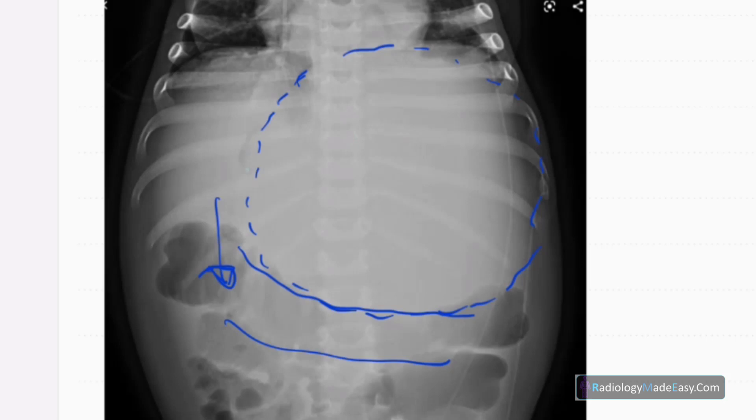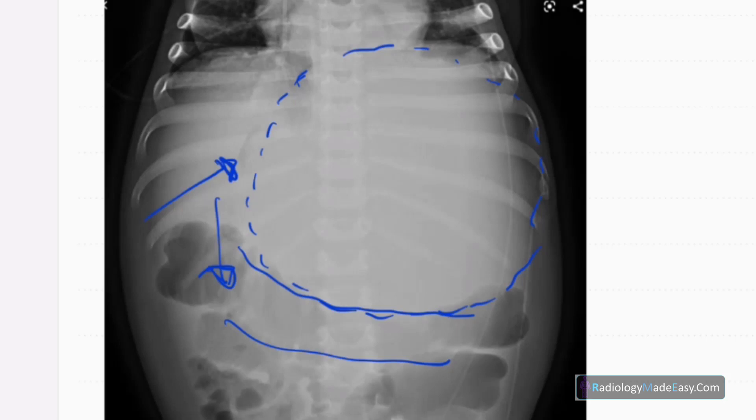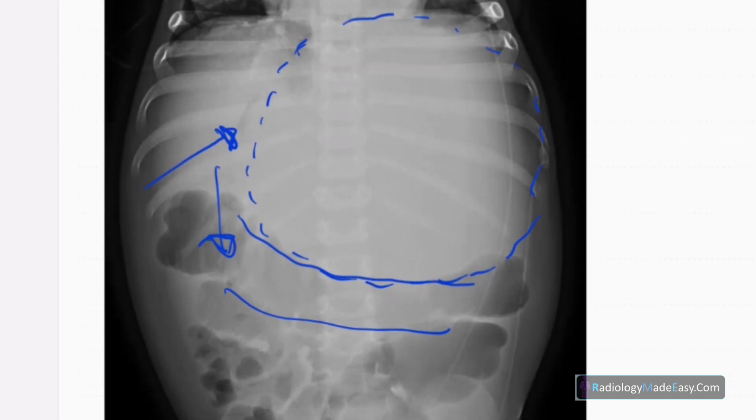And you can see some lucency on the right side. So this is probably the displaced stomach due to this mass. You can see the gastric bubble is displaced to the right side and compression of the stomach. So all the bowel loops are displaced inferiorly. Probably there is a mass in the left upper abdomen.